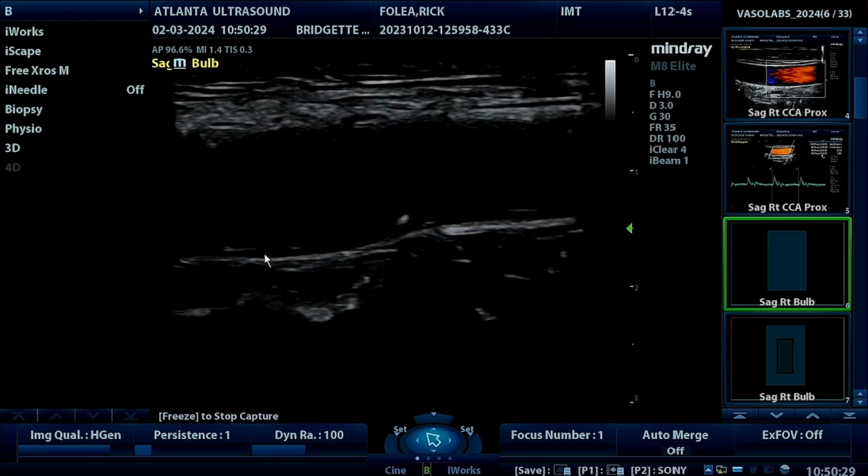The bulb's hard to see because we're looking at the bulb from this side. Picture one split heading to the left and one heading back into the screen. We'll see better views of the bulb later in the video.